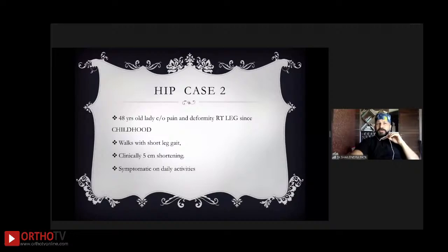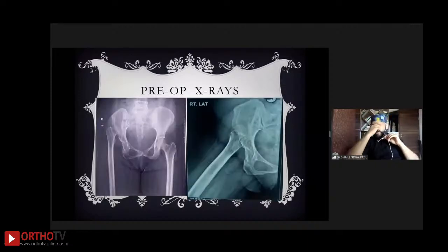When we calculated, it was almost 5 centimeters of shortening. After so many years, the patient has become symptomatic in daily activity, with fatigue, thigh pain and back pain developing. Now they are demanding surgery. They came with this X-ray picture. We tried to get an AP and lateral view.